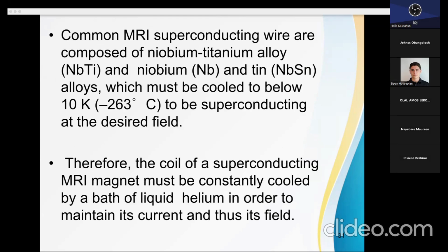But then you have to maintain the temperatures pretty low to be able to do that. So in environments where we have regular power outages, for instance, maintaining such systems becomes a little bit difficult, because now you have to run diesel generators that consume a lot of power and things like that. So it's a cumbersome system, especially for the low and middle income countries.